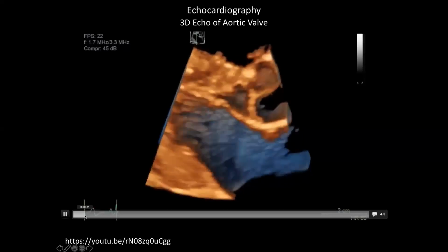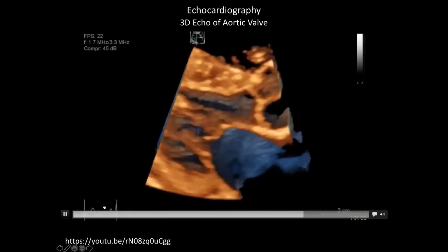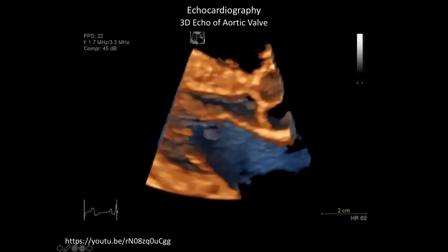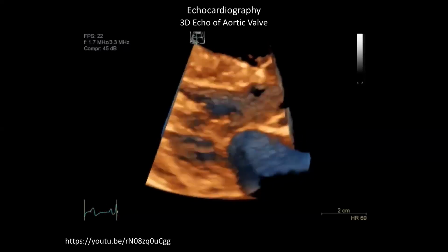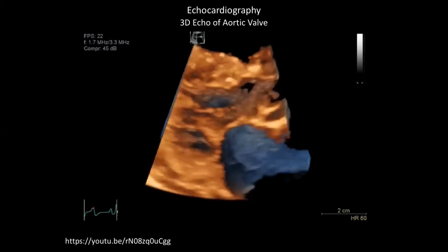And again, here's the heartbeat. QRS is down, so it tells you at which phase, if you look at the little red dot, you're at. And this is normally an average of a series of QRSs that were used to make this 3D volume.